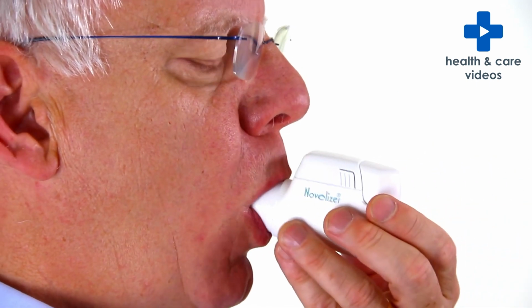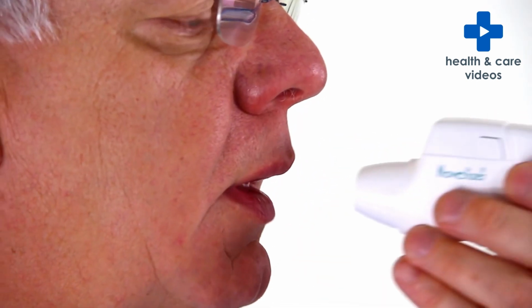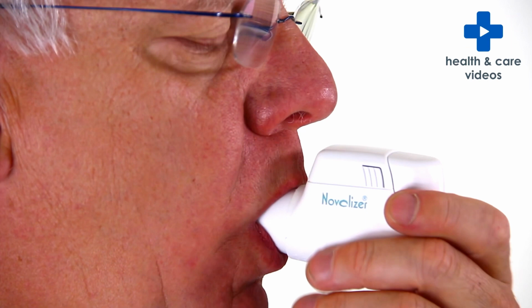When you're ready, breathe out gently as far as you comfortably can, but not into the mouthpiece. Now, place the mouthpiece into your mouth and between your teeth, but don't bite down on it. Close your lips around the mouthpiece to form a tight seal. Make sure that the button is still pointing upwards.